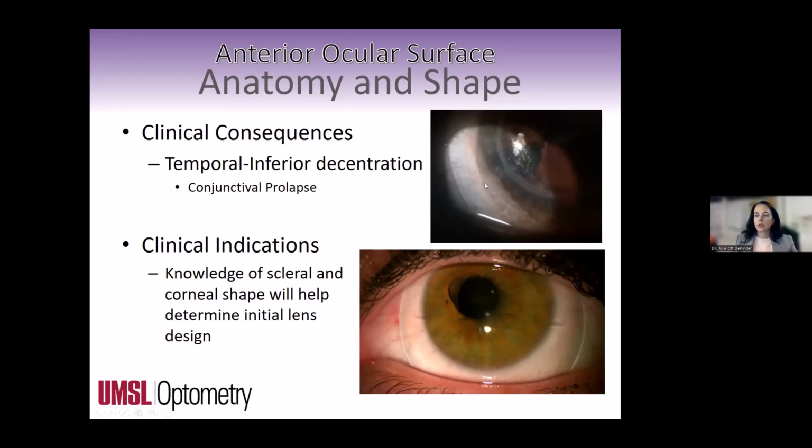And the next thing you want to do there is thin out your limbal. Don't have too much limbal clearance. So a tight periphery and then decrease limbal clearance to where maybe 50 microns is going to help you get rid of something that looks like that.